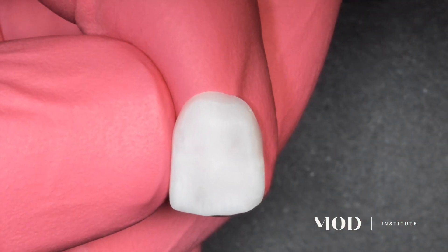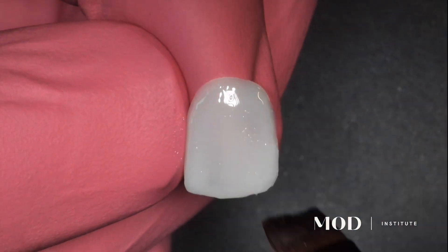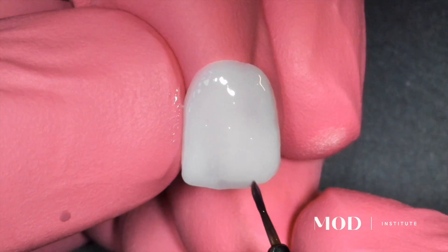Heat it up to 50 degrees Celsius to make it super flowable, then paint it onto the surface of your restoration. This could even be a restoration that's already been placed many years down the line and you want to refresh the candy coat.